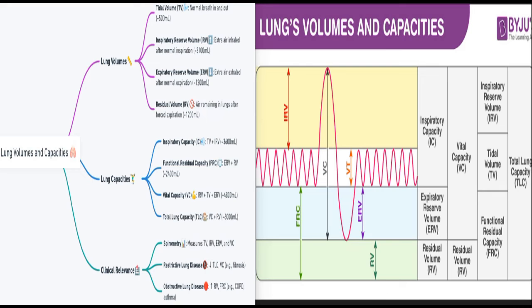So with this, you could say it's possibly a mixed obstructive restrictive lung disease, and possible restrictive pattern. Both the FEV1 and FVC have been reduced with the ratio preserved at 70%. So with a result like that, you need the full lung volume and DLCO testing to differentiate the pure restriction from the mixed ones. Right.